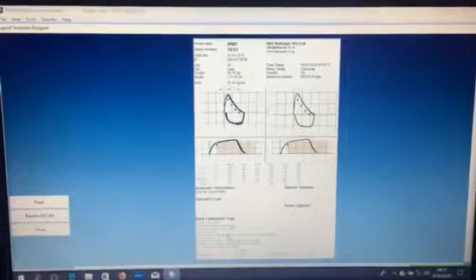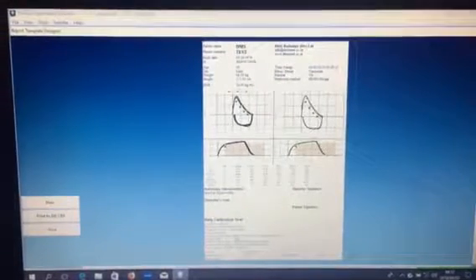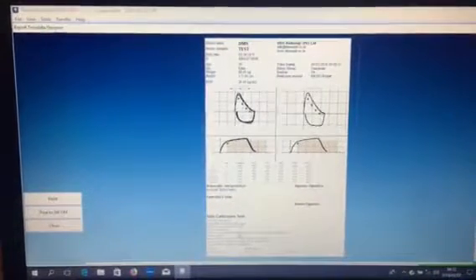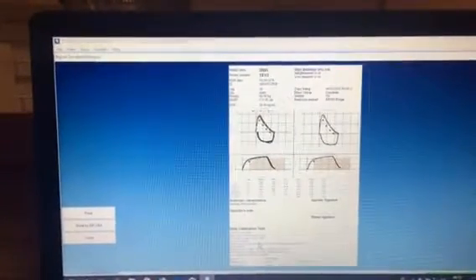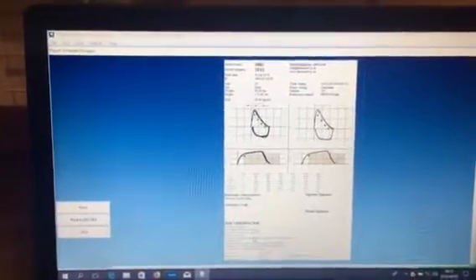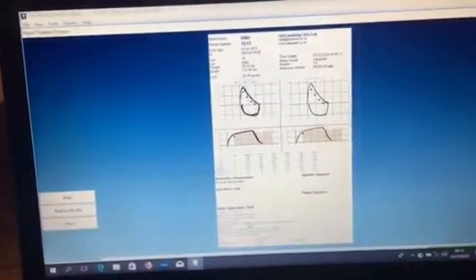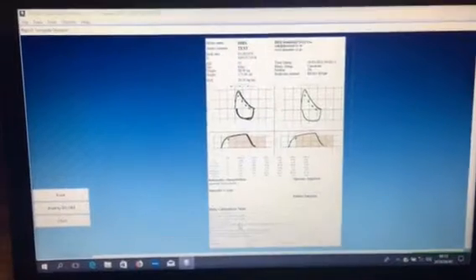As mentioned, all the information will be on the website www.dmsmet.co.za or on the protective casing that the DMS Spirotube comes in. Also on the DMS Spirotube itself, all the information for contact details to make contact with a DMS technician will be on the device itself.